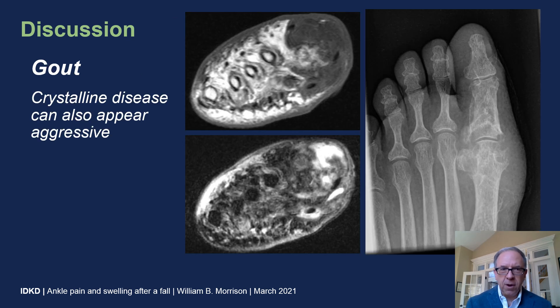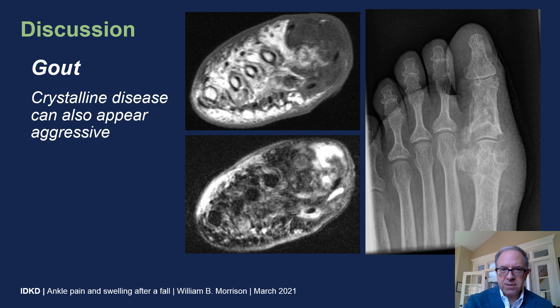One pitfall: crystalline disorders like gout can look very aggressive in the surrounding soft tissues. Here we have destruction of the first metatarsophalangeal joint with surrounding fluid and soft tissue edema, which can mimic the appearance of infection.